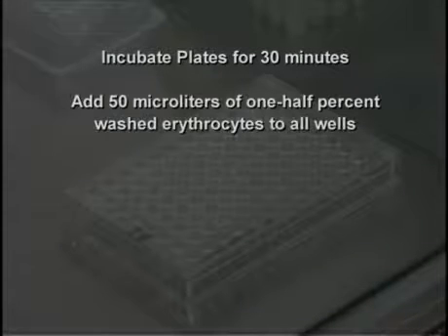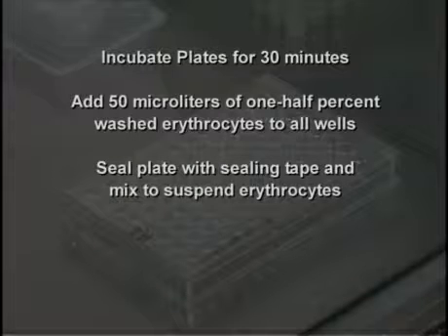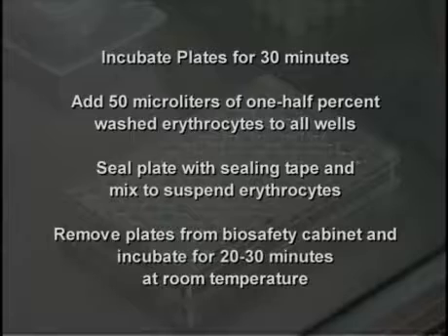Following the 30-minute incubation period, add 50 microliters of 0.5% washed erythrocytes to all wells. Seal the plate with sealing tape and thoroughly mix to suspend the erythrocytes. Remove plates from the biosafety cabinet and incubate for 20 to 30 minutes at room temperature.